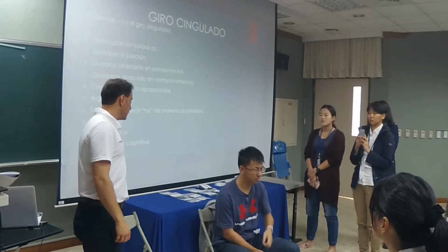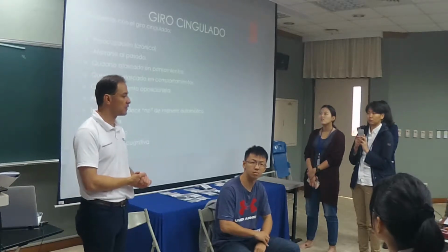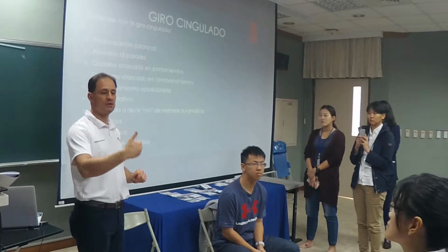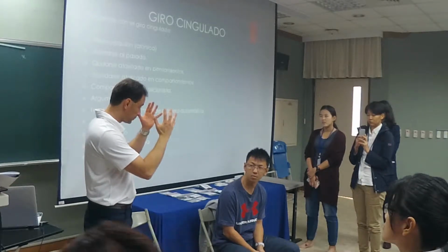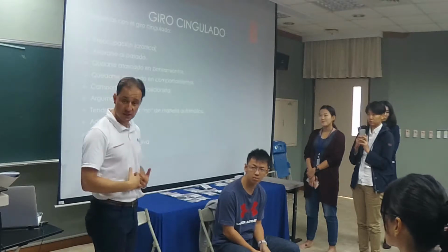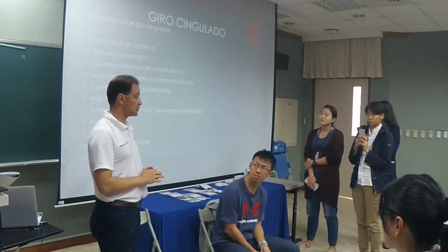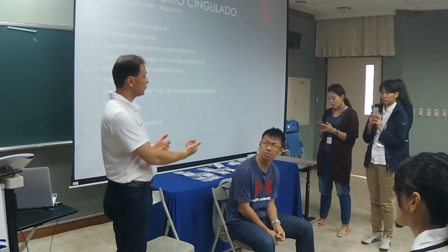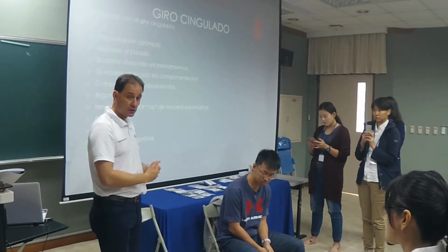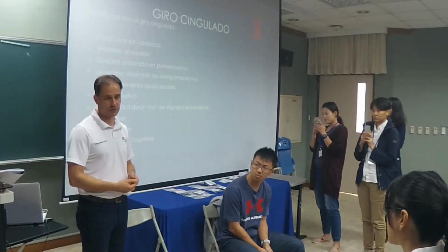So why do we do a stress profile? Well, because we want to see how stress is affecting our client from a psychophysiological perspective. So we're going to stress him psychologically, and we're going to see what his physical reactions to it are. That's going to give us a lot of information about how he reacts to stress, and it's going to help us work as a team to come up with a good intervention protocol for him.